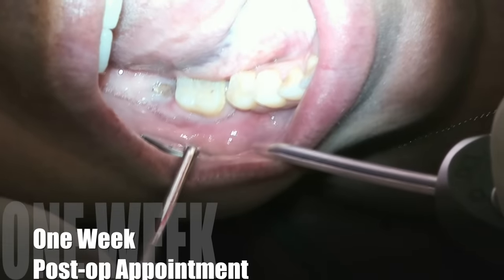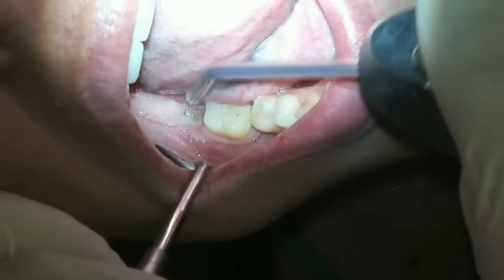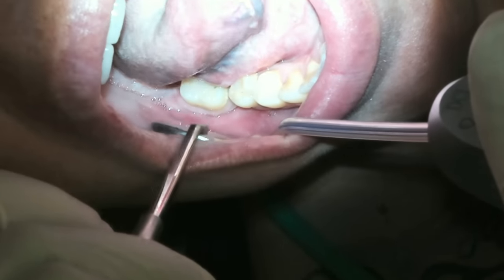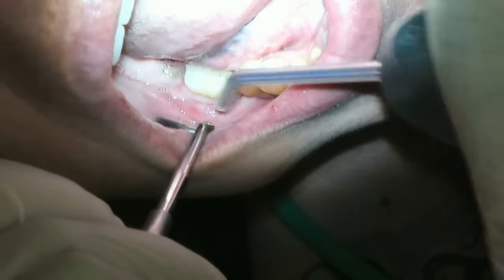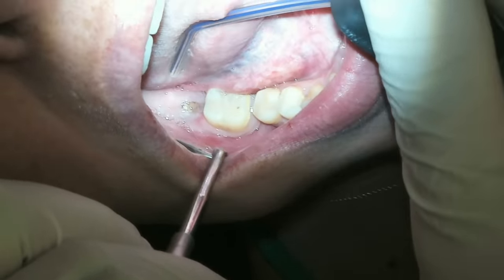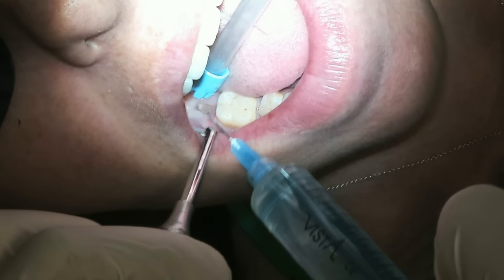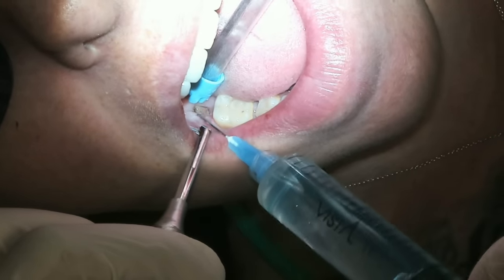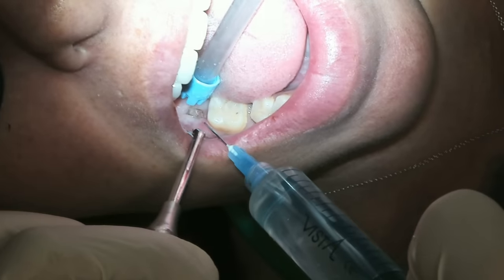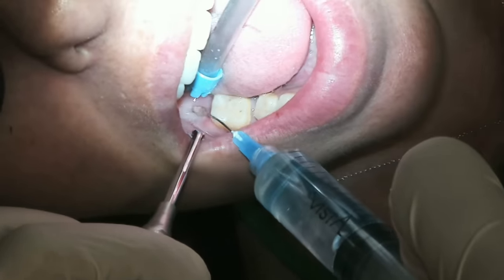Here is our one-week post-op. Only one week after the extraction, the swelling has gone down considerably. After about three days, we called the patient and they stated they were feeling much better. We go ahead and irrigate the area and make sure that it's nice and clean and that there's no food impaction occurring. Thank you very much for watching and take care.